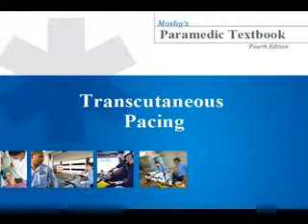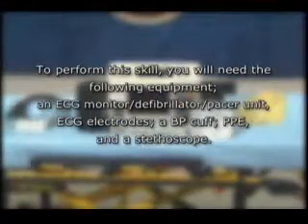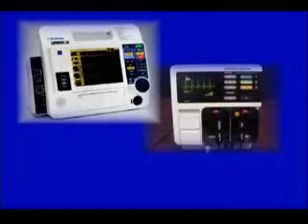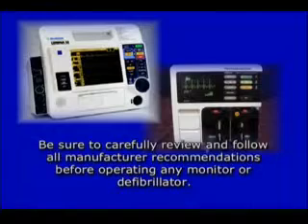Transcutaneous Pacing. To perform this skill, you will need the following equipment: an ECG monitor defibrillator pacer unit, ECG electrodes, a BP cuff, PPE, and a stethoscope. Monitor, defibrillator, and pacer operation may vary widely depending upon the manufacturer. Be sure to carefully review and follow all manufacturer recommendations before operating any monitor, defibrillator, or pacing unit.